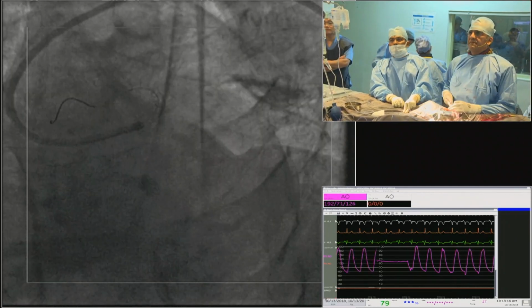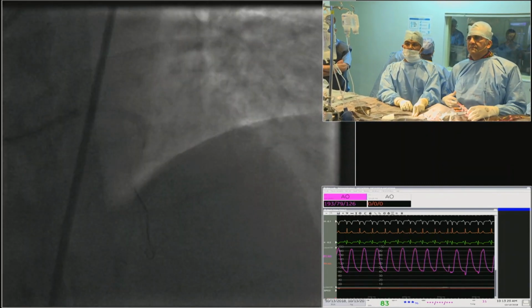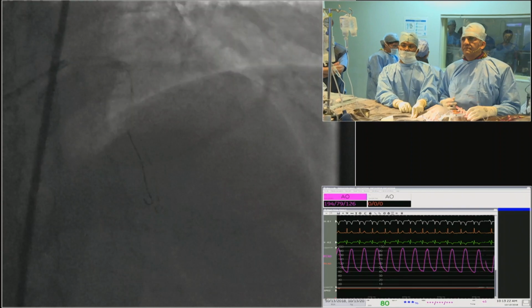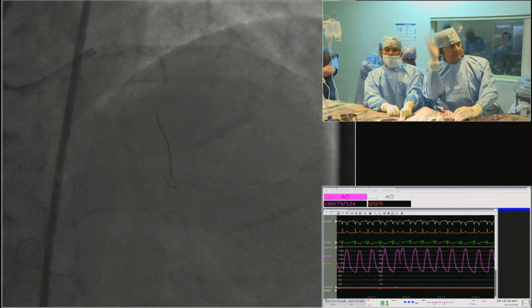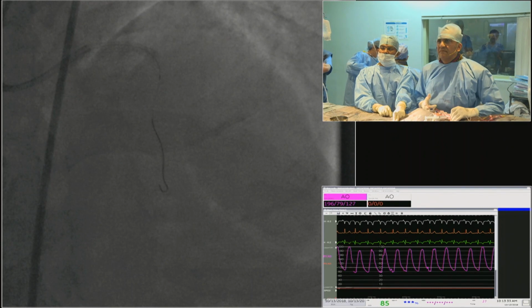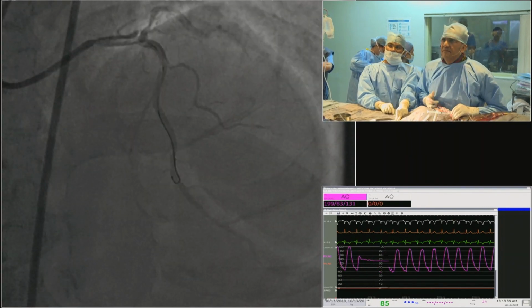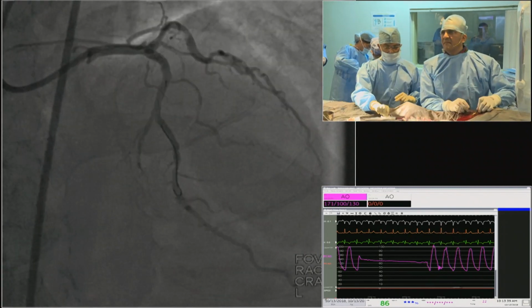One issue is the size of the stent that he is now choosing. 2.5 I think is small. What is the landing zone on the IVUS? The distal landing zone is about 3, if I'm not wrong. No, it was measured at 2.5. Angiographically, it was certainly more than 2.5 if you go by the external elastic lamina.